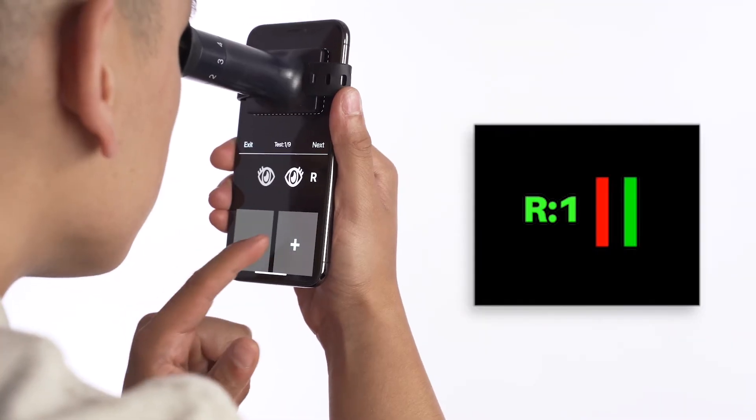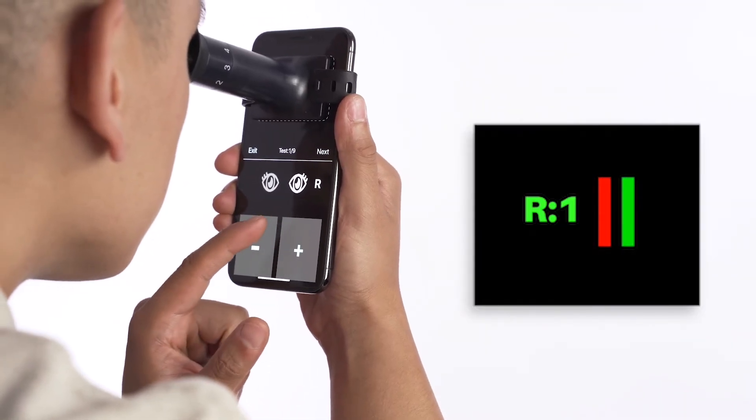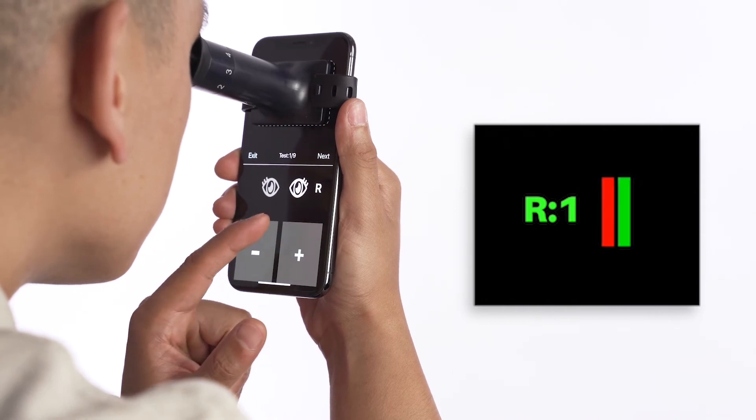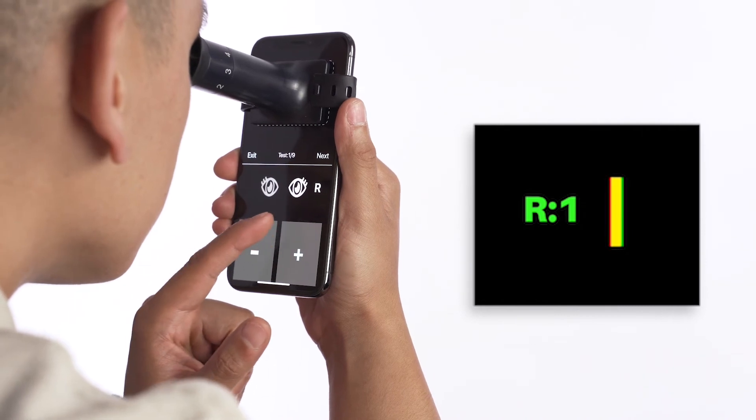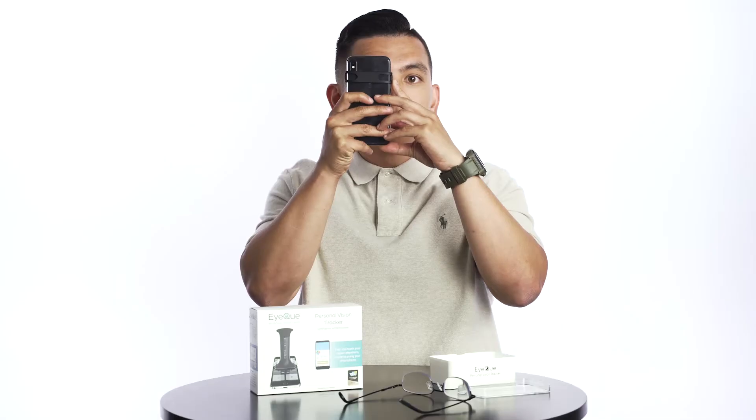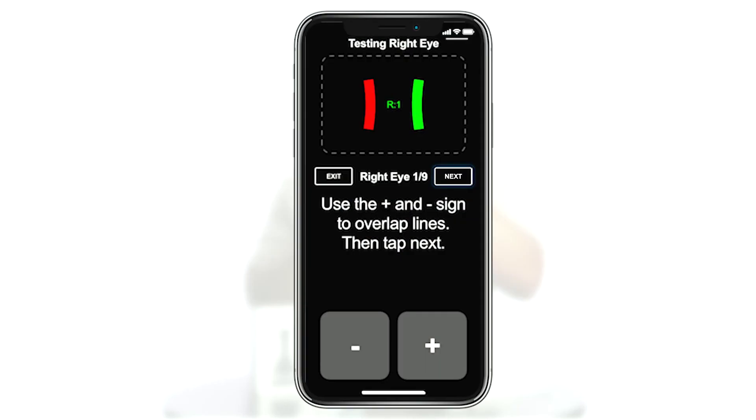Now, use the plus and minus buttons on your phone screen below your device to overlap the red and green lines to form one solid yellow line. Once you're satisfied that the lines are overlapped into one solid yellow line, move the device away from your eye and select Next on the screen below the device.